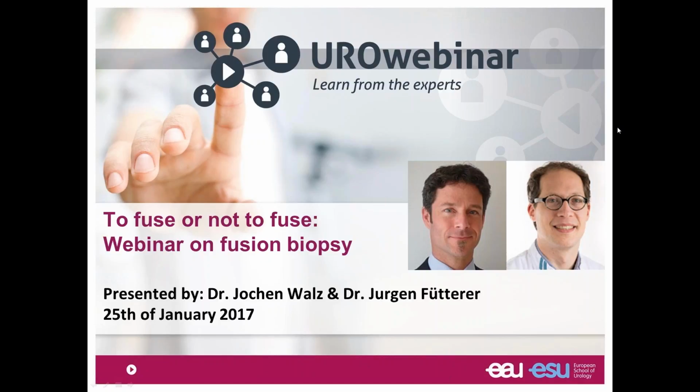But we need to be very careful if we use targeted biopsies, and as I was showing you, if we apply the classical active surveillance criteria to these targeted biopsies, then we do not offer active surveillance to many patients anymore, because again the risk is inflated and we do poor clinical decision making in this setting. And unfortunately, we do not yet have clear, accepted and validated criteria for active surveillance or non-significant disease based on targeted biopsies. There are some suggestions, but they are not generally accepted, and we really need to be careful, especially with the number of positive cores.